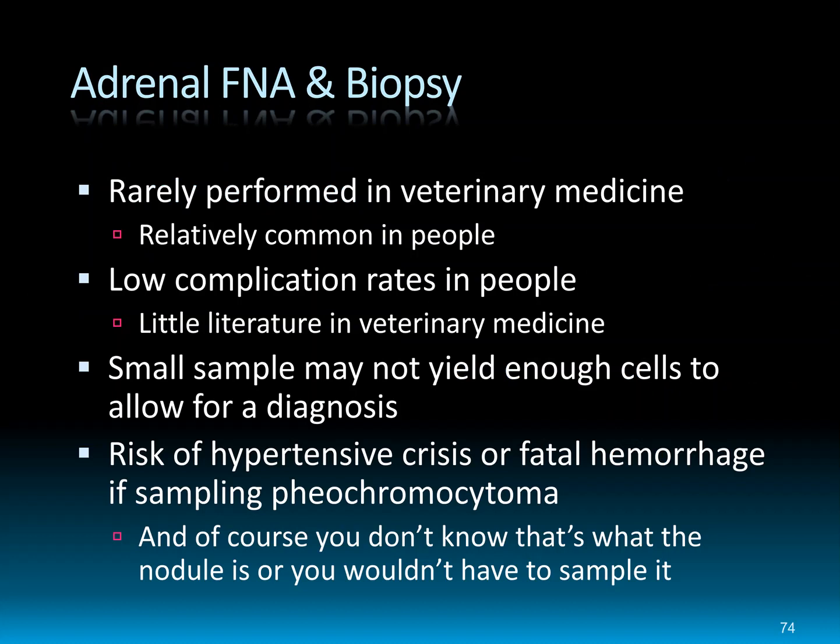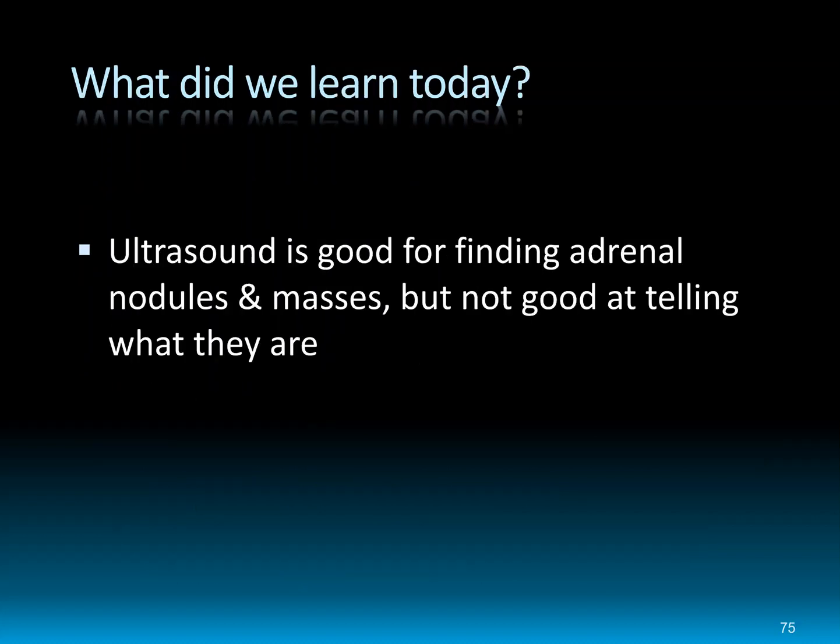We rarely sample adrenal glands in veterinary medicine. It is done in human medicine with low complication rates, but usually we're not doing it. I think people have enough concern that if the nodule in question is a pheochromocytoma, we're going to cause big problems, so they tend to kind of shy away. So it can be done, but it's not routine by any stretch of the imagination. It's almost never done, so I won't spend much time there. So that brings us to the end of adrenal glands.